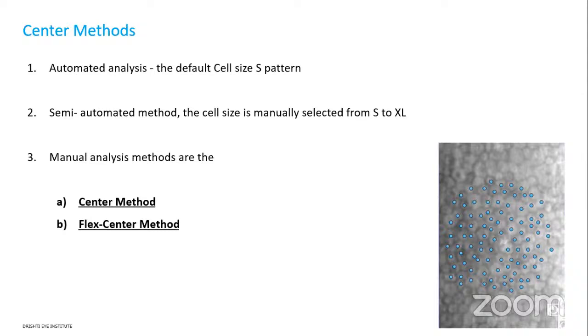So we have to correlate clinically always, and in more advanced cases, specular is not really useful. Just like advanced keratoconus, where there's significant scarring, the Pentacam is of no use really. The same happens with the specular. When the cornea is really bad, specular really doesn't help.